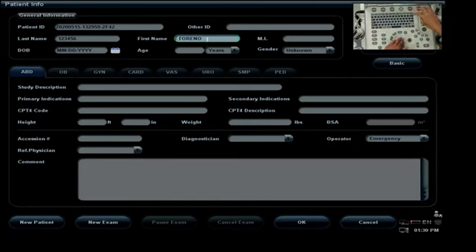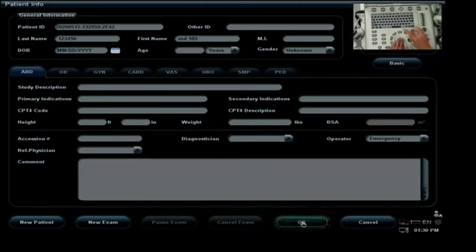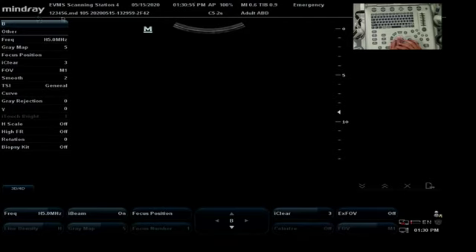And often you may be instructed, instead of putting your own name, since you have your ID, you may be instructed to put your course instead. So it might be MD, let's go this way, MD 105, just as an example. So you're going to have a couple of different choices, and then we're not going to do anything else here. We're going to come down and we're going to hit OK and accept that information, and then you can see that your ID and either your last name or your course number will be saved here on your machine.